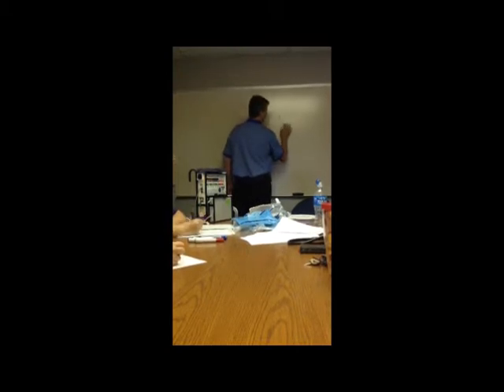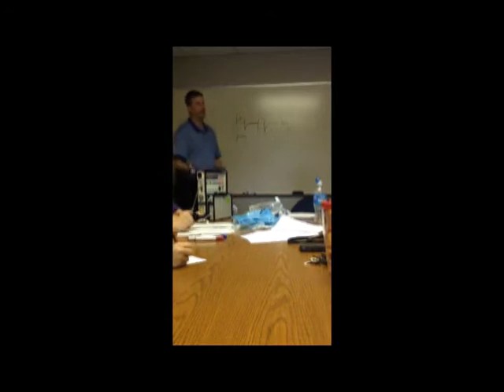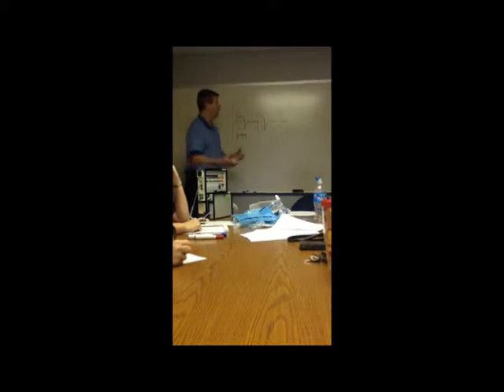All right? So say it gets to the next breath here, it gets to baseline. If you had set the vent to hold their breath for half a second even, then they would exhale out. That actually is technically part of the breath too, but you don't use that in practice. We use that in 1 in 1,000 people. The only reason we would use that is in some of the sickest people with oxygen issues. We make them hold their breath to help them oxygenate.